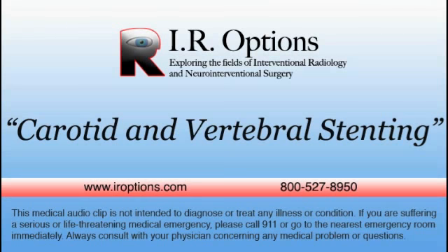The occurrence of a TIA prompts the immediate evaluation of the affected individual with either an ultrasound neck exam, called a carotid duplex study, or CT or MR angiography. Once a severely narrowed neck artery, most commonly the carotid artery, is identified, it can be addressed by traditional open surgery, known as carotid endarterectomy, or through less invasive endovascular stent placement.